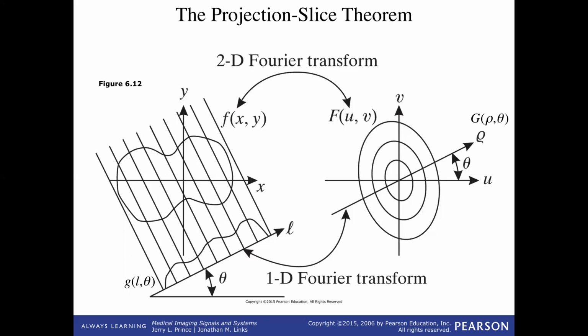So that's called the projection slice theorem. And it's absolutely essential really as a step towards creating convolution back projection, which will be the correct way to do back projection. We did naive back projection first, and we got these blurry pictures. We now look at the projection slice theorem, and this is going to give us a big hint on what we need to do in order to make a back projection algorithm that is correct, and it's going to be called convolution back projection.